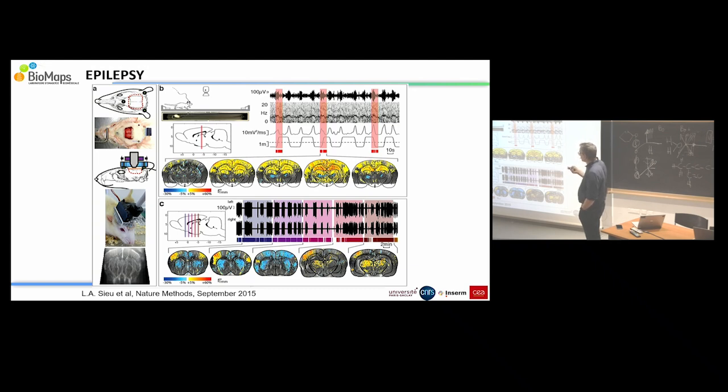So this is a kind of surgery that she applied, with here the connector for the electrodes that are inside. The skull is removed and replaced by TPX. It's a kind of plexiglass, so you can keep your animal for months without any problem, and you can use it to do multiple experiments. The probe is fixed on the top with this small screw, and you can follow its life for different applications.